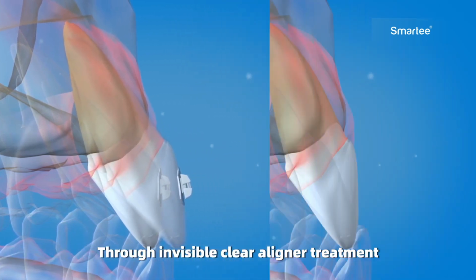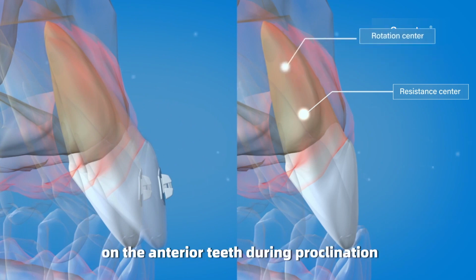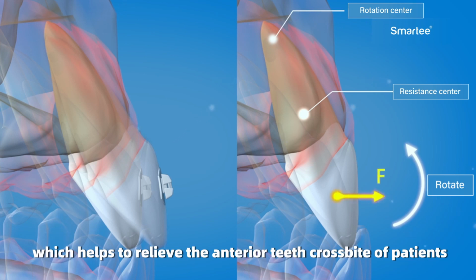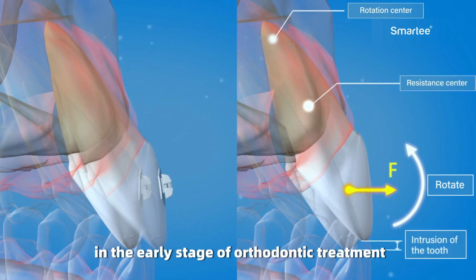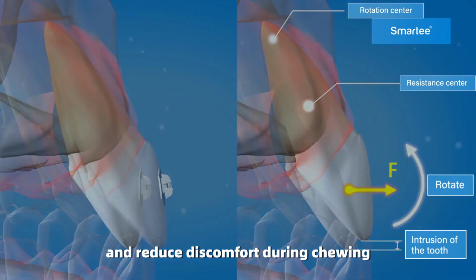Through invisible clear aligner treatment, there's a significant relative intrusion on the anterior teeth during proclination, which helps to relieve the anterior teeth crossbite of patients in the early stage of orthodontic treatment, to avoid occlusal trauma and reduce discomfort during chewing.